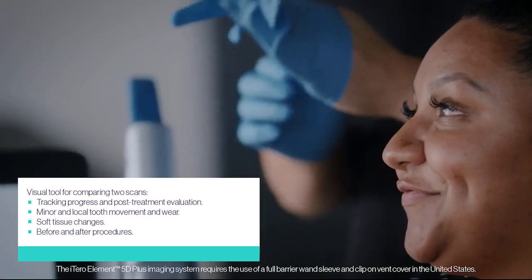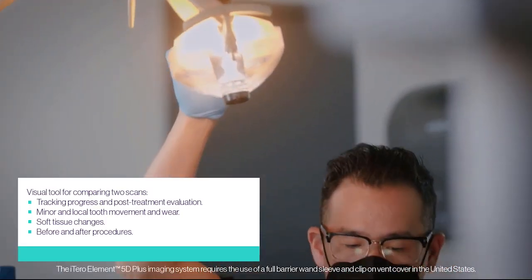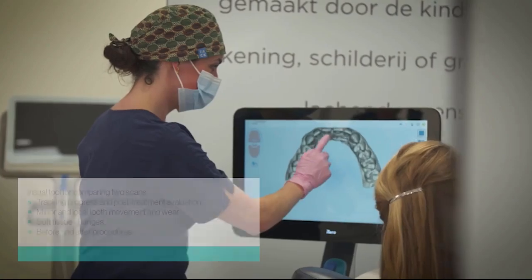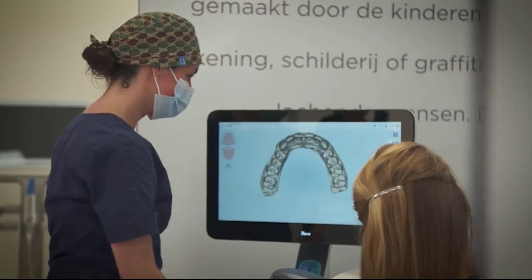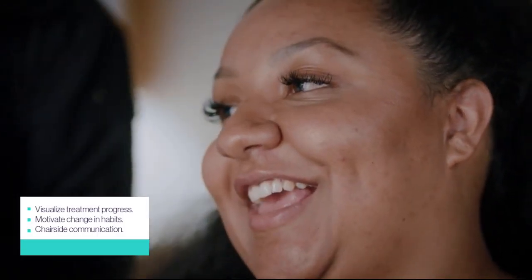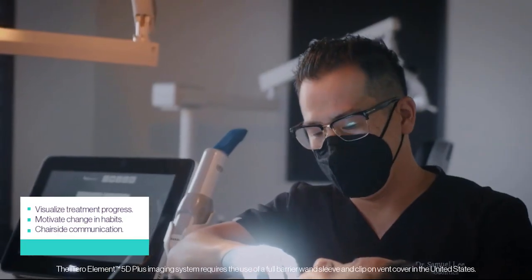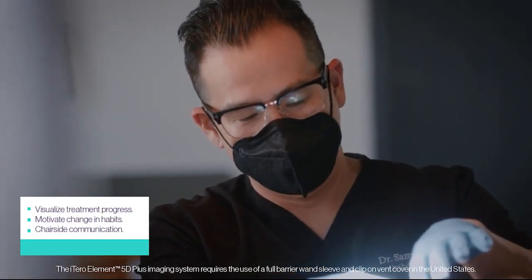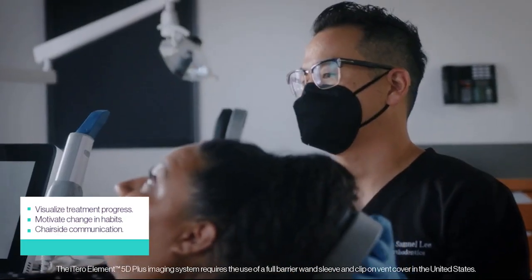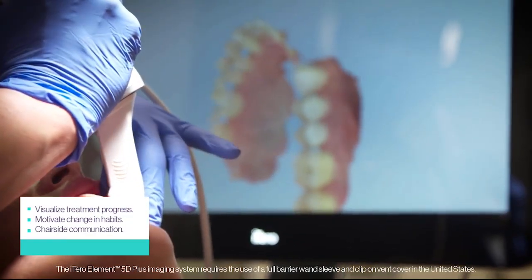The iTero time-lapse technology helps you visualize tooth wear, tooth movement, and gingival changes over time. Time-lapse also helps your patients visualize and understand treatment progress and achievements through a unique digital experience.